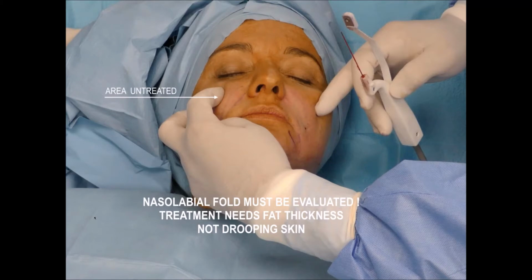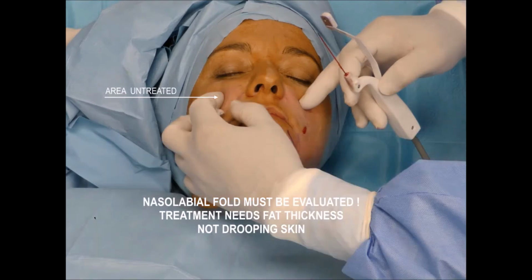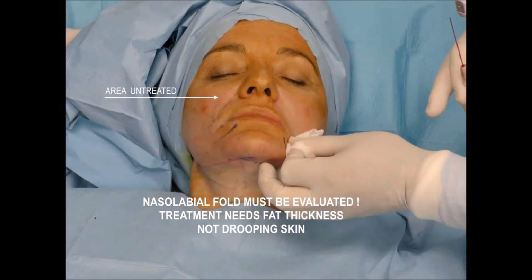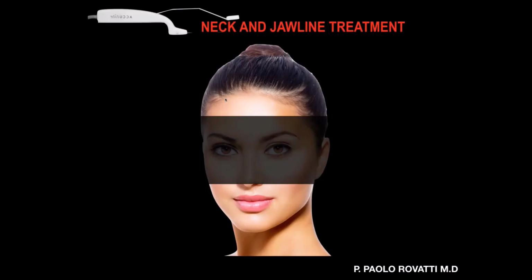But now look at this video. Sorry always for the not smooth video, but on the left side is treated, and the right one is not treated, but you can see that the fat is still there and is here. Look, this area is still untreated. So we start with the neck and jawline.